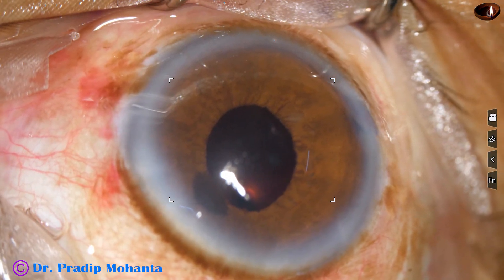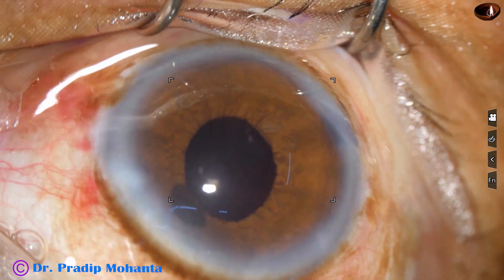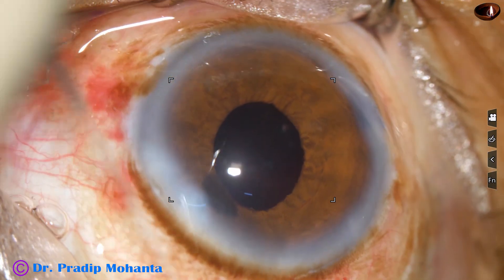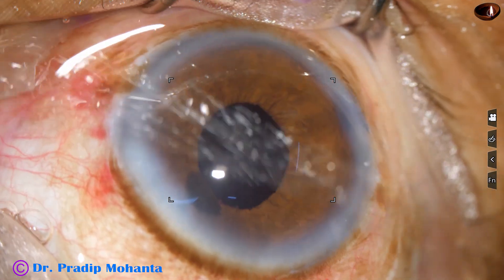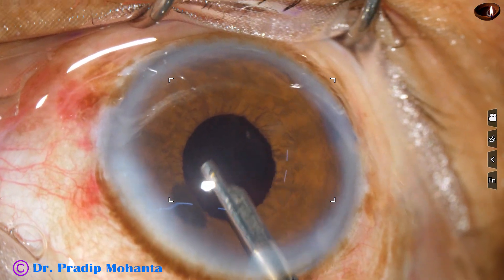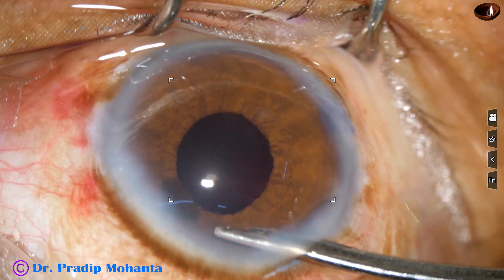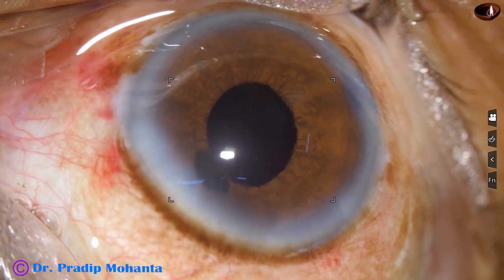This is a beat of moxifloxacin. Now the side ports are closed by hydrating the corneal stroma on either side of the side ports. And now a final lavage of the anterior chamber and formation of the anterior chamber. At this time I use a 23-gauge Simcoe cannula to form the anterior chamber very nicely, and conclude the case.